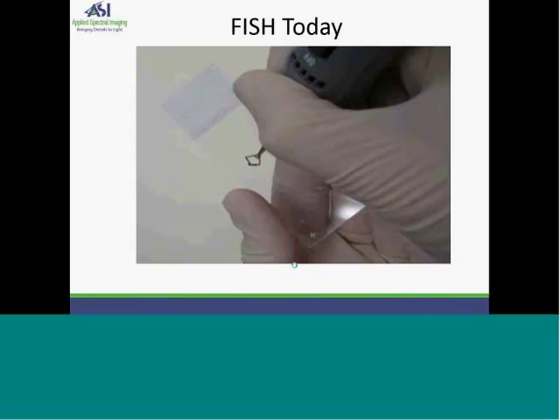However, this workflow has a number of problems with it. First of all, there is a difficulty of transferring the region of interest to the FISH technician. How is the region decided upon? Was it the best region of interest? And there's the difficulty of working with a diamond engraver on such a small area.